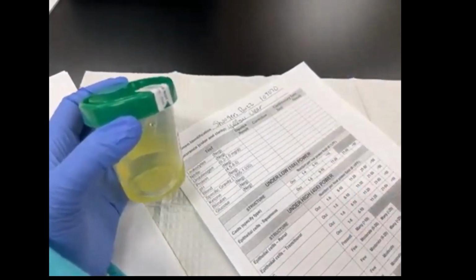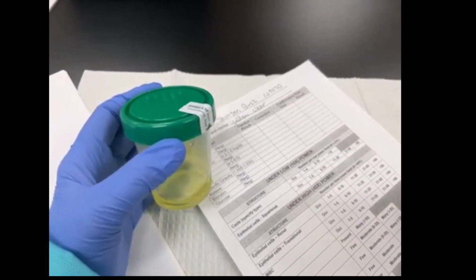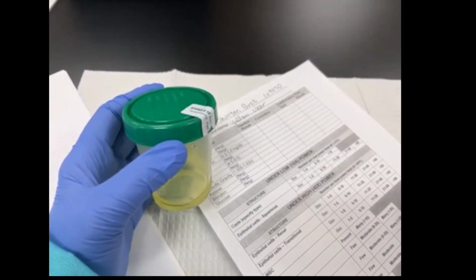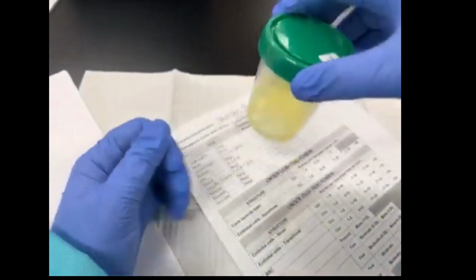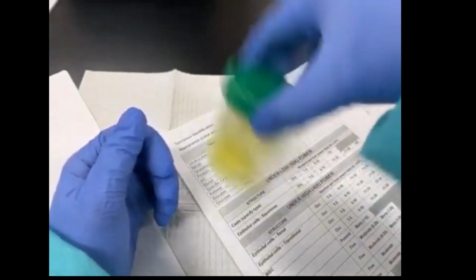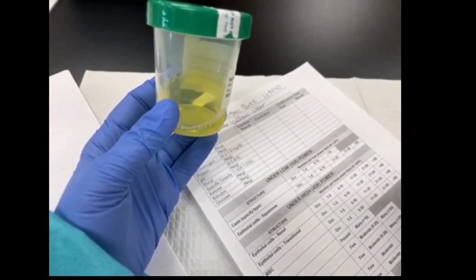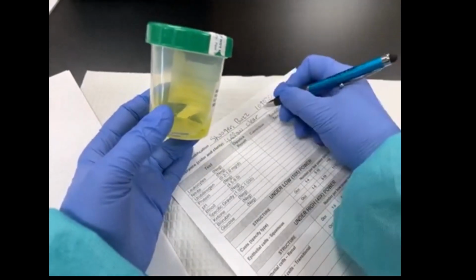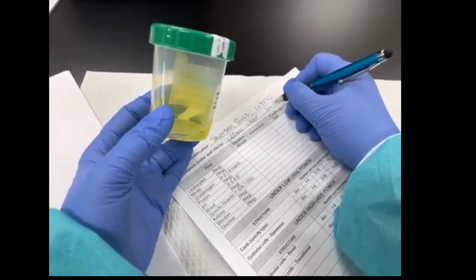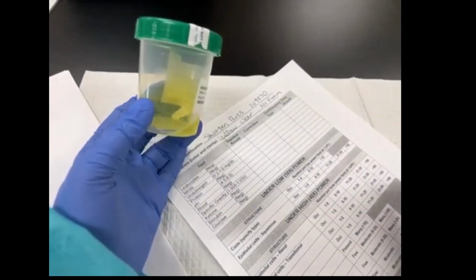Then the last one that we really look for is odor. We're not actually going to open this up and smell it. I can tell you during some of these labs when you open up, we'll know what's going on in these urines, but I don't have anybody waft them because that's just kind of on the gross side. But we do give it a nice swirl to look for foam. So I'm going to swirl it and I'm going to look for foam and see how those bubbles are just going away. That is not foam. That is just regular bubbles. So no foam. It's most important if there is foam to recognize that there is foam. But in this one we can write no foam.